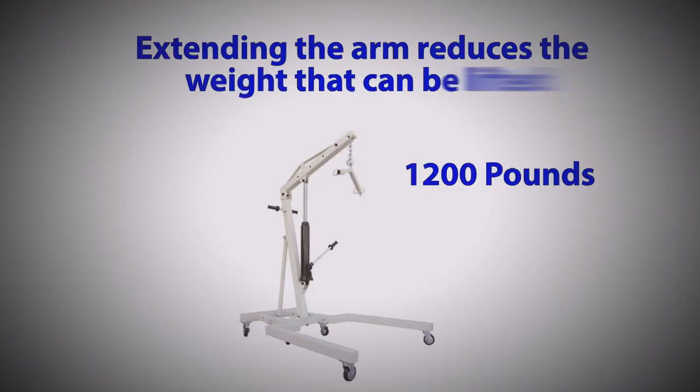The boom extension arm is adjustable. When not extended, the device can lift a maximum weight of 1,200 pounds. However, when the boom is extended, the maximum weight the device can lift is just 800 pounds.